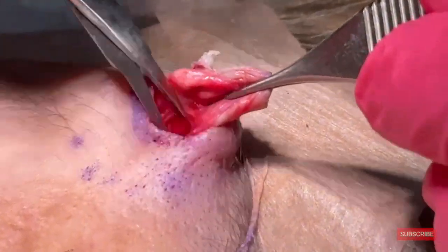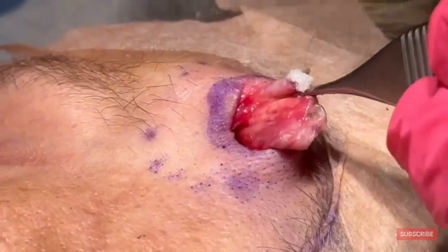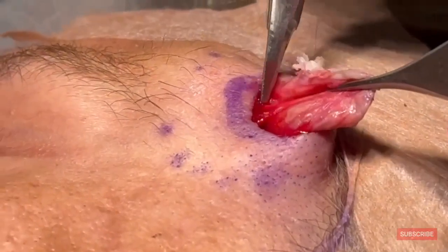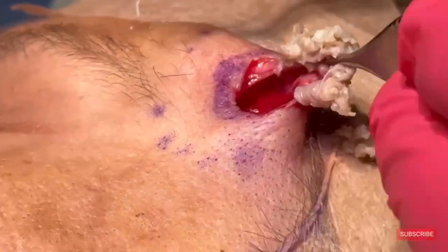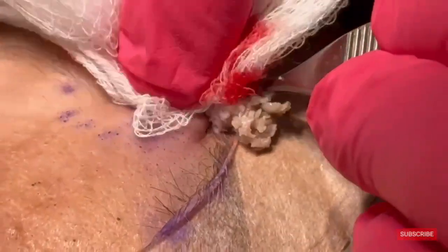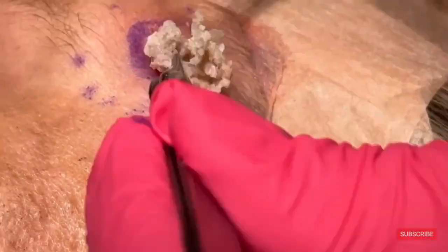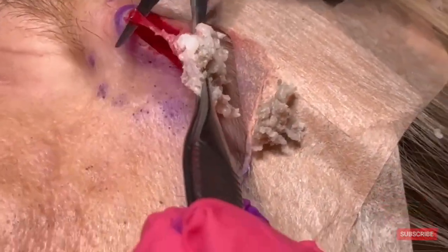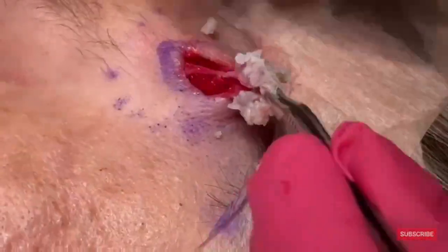And this cyst decided to go deep, as we knew. Now, what structures here do you have to consider? And we just did it beautifully here. Beautiful little temporal branch. You never want to cut, because as soon as you're cutting, you are deciding something. And you never want to be deciding something, because if you don't understand all the little fibers that I just described to you, you will be forcing your decision onto the body. And then you're going to be cutting stuff that you shouldn't be cutting.